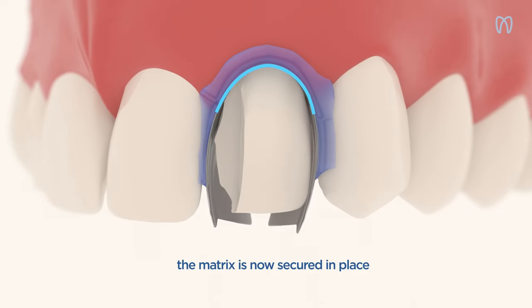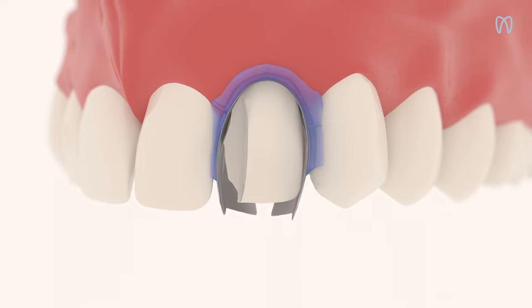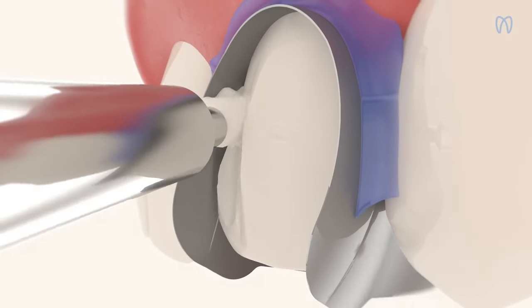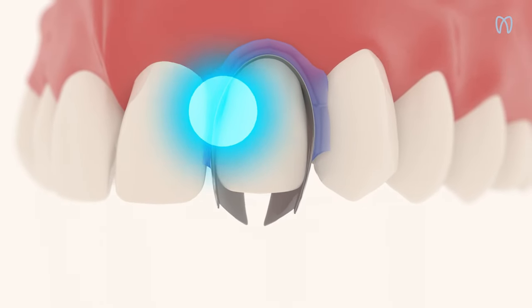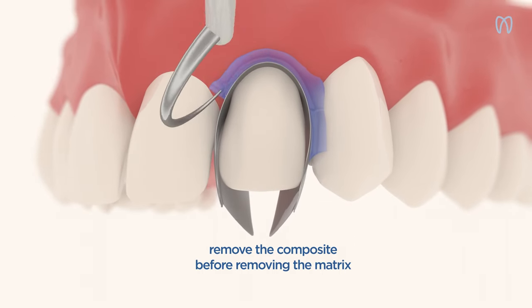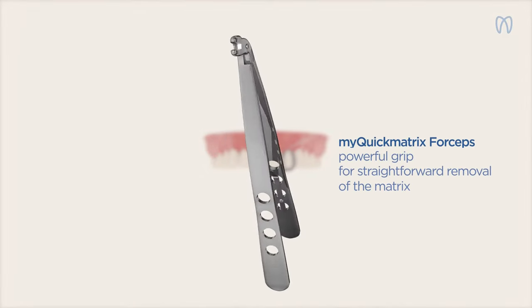With the matrix secured in place, you can now proceed with the adhesive procedure. Once finished, go ahead and remove the matrix with the powerful forceps included in the system, MyQuick Matrix Forceps.